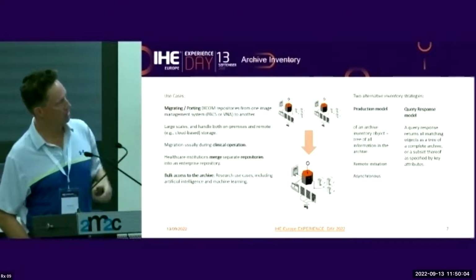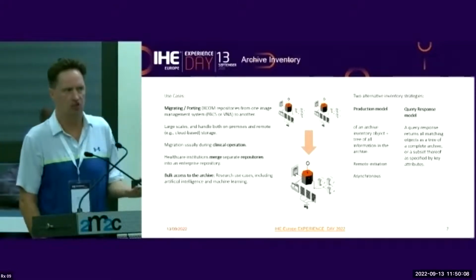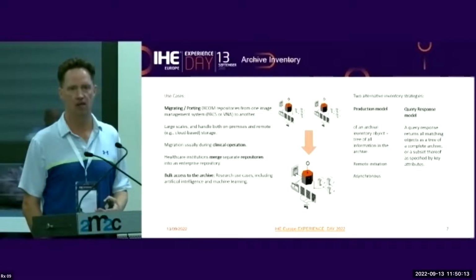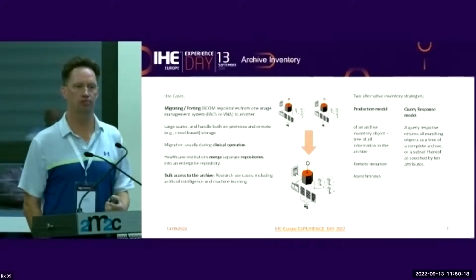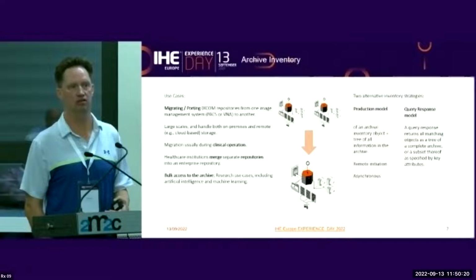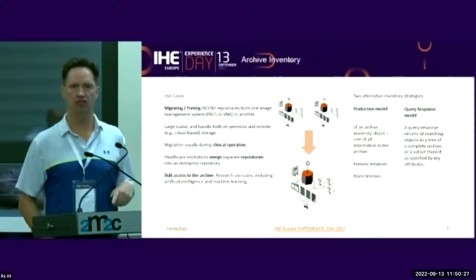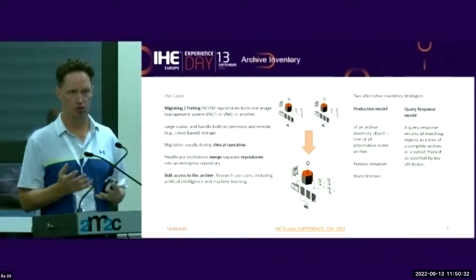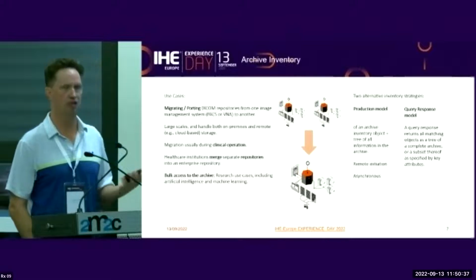So there's also another interface, and that's a query retrieve interface. And then some would say, but there's already a query retrieve interface in DICOM. But that's not complete. With the normal query retrieve, you could not port or migrate a complete archive. So there's a new query retrieve service for archive migration that's really complete, so that you can get everything out of an archive into a new archive. So there are two possibilities within the standard to do migration of big PACS systems.